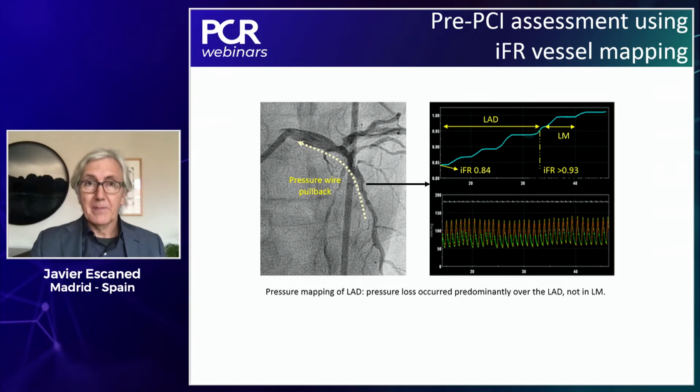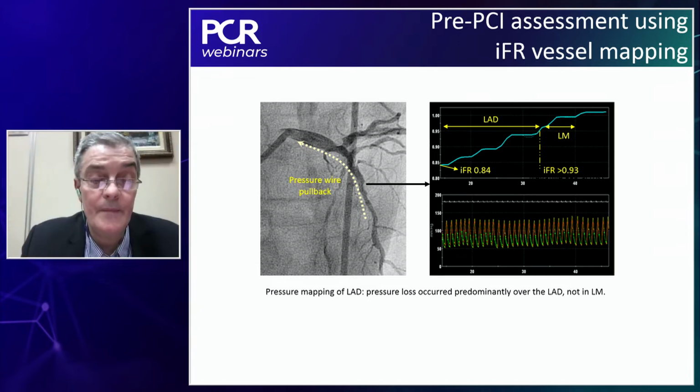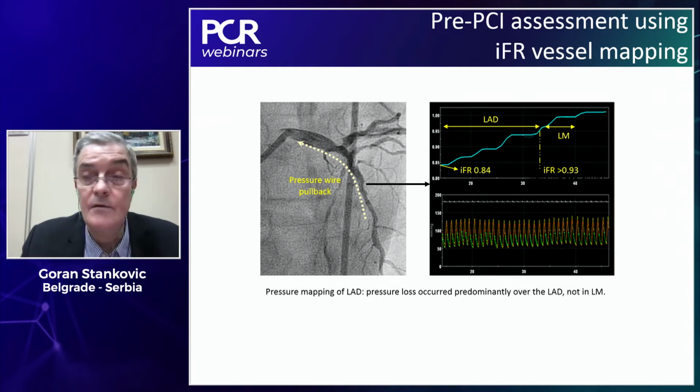Javier, we have a question from Carlos Uribe, our friend from Latin America. We don't have intravenous adenosine, only intracoronary adenosine. Is it safe to defer left main PCI procedure based on intracoronary adenosine assessment? And what other options do we have?